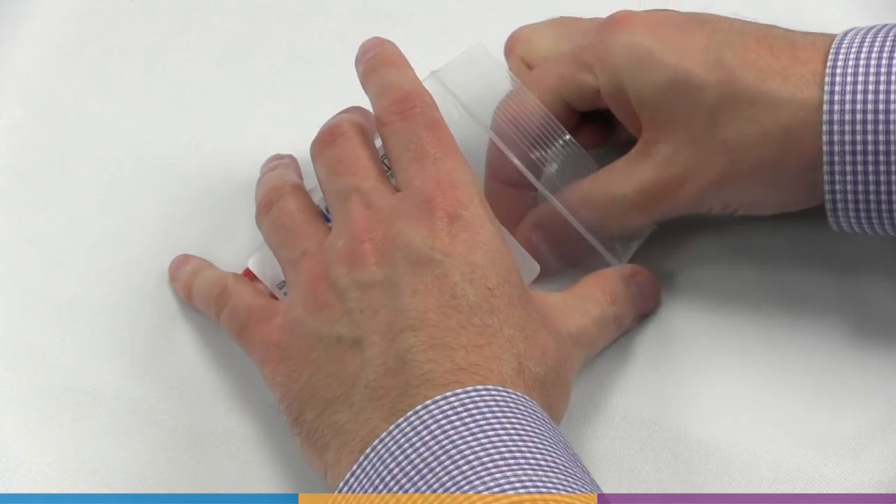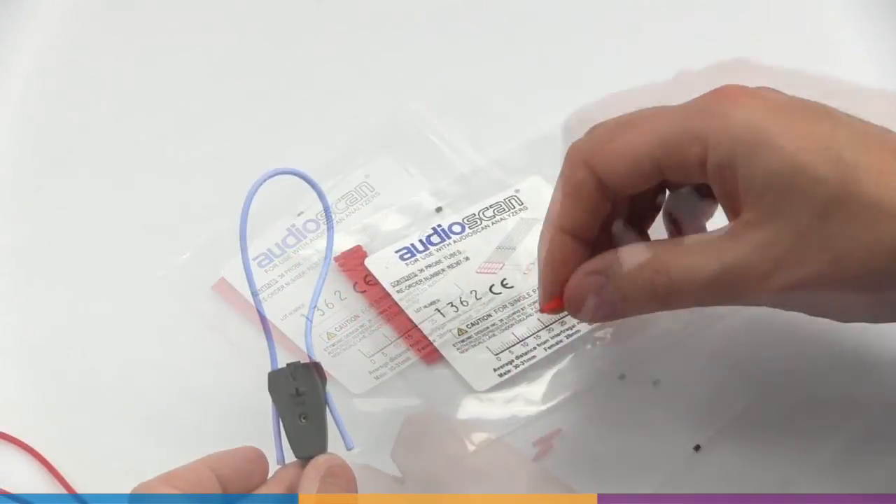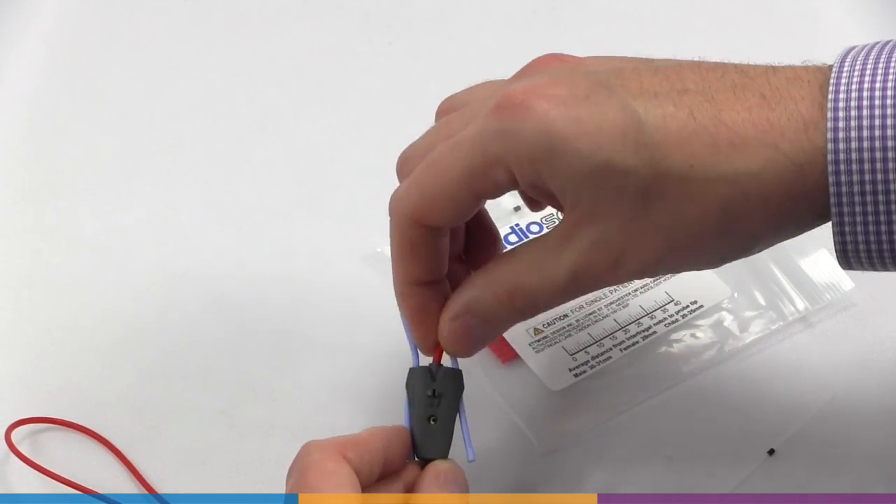Install a new probe tube on the probe module. Do not attempt to use sterilized probe tubes, as residue from the process will damage the microphones.